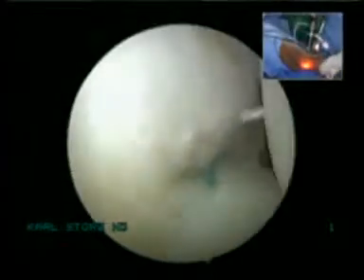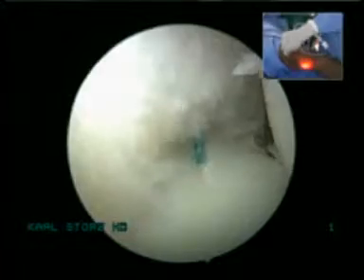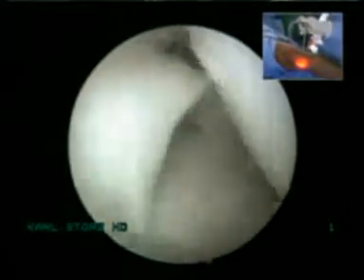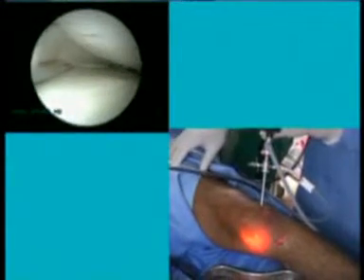I applied the second outside-in suture. And I have already applied one FasT-Fix in the posterior horn. Okay. And now I tied the knot. Can the camera person show a slightly bigger external picture so that we have a better idea of what you're doing? Let's see. A 50% inside and a 50% outside picture. Here am I. That's great, thank you.